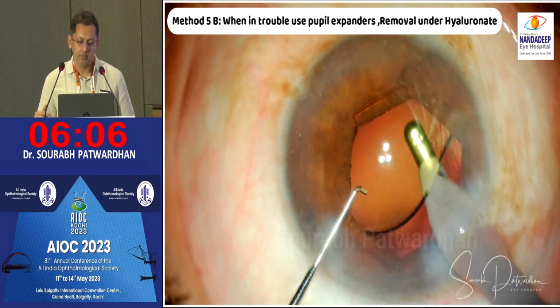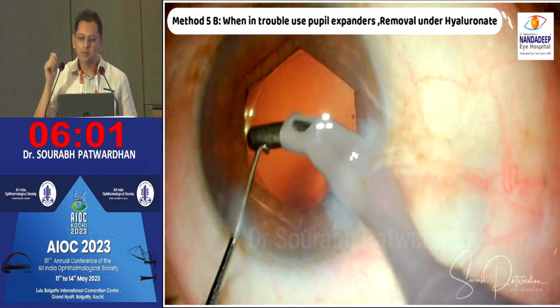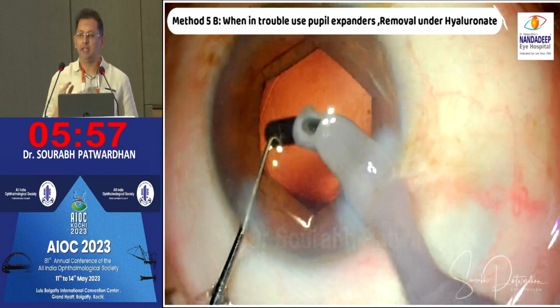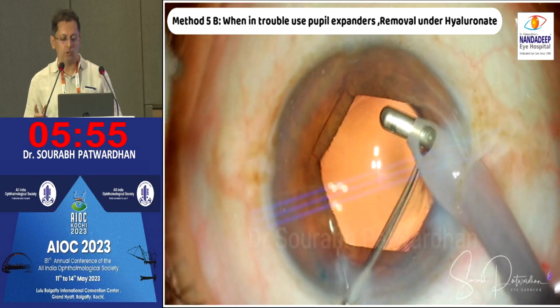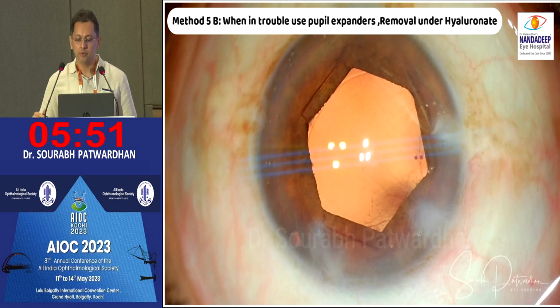Just as the previous speaker showed, the most important part if you want to improve accuracy is to remove that viscoelastic from the posterior surface of the IOL, that makes it more sticky and stick to the posterior capsule much more easily. So now the IOL is well aligned.